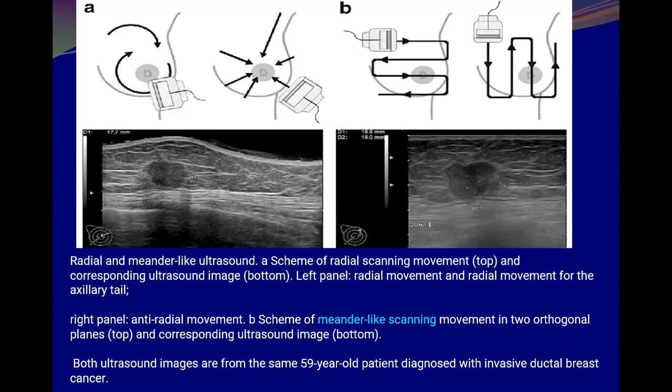But in this case, if I could not see the maximum dimension of the lesion, that means I'm not along the long axis of the duct related lesions. I will rotate, I will angulate my transducer more obliquely until I reach the maximum length, the maximum dimension of the lesion. When I get the maximum dimension of the lesion, that means I am in the radial for that duct.